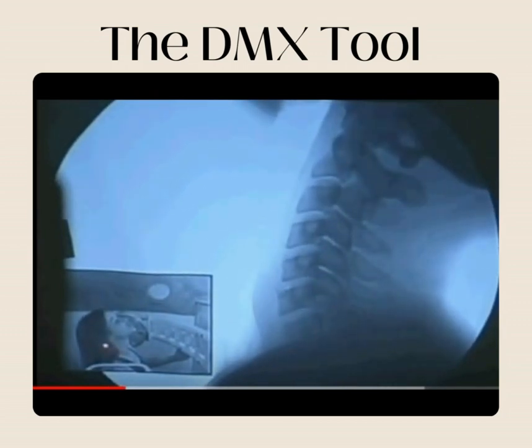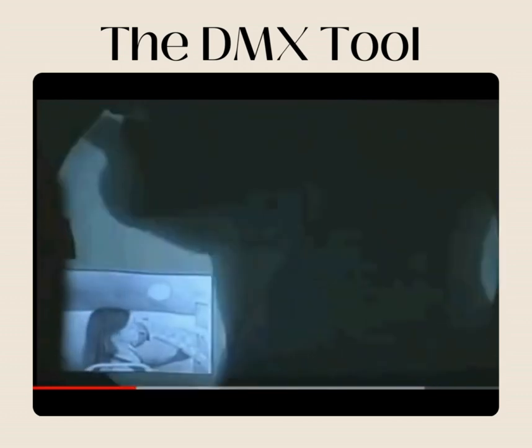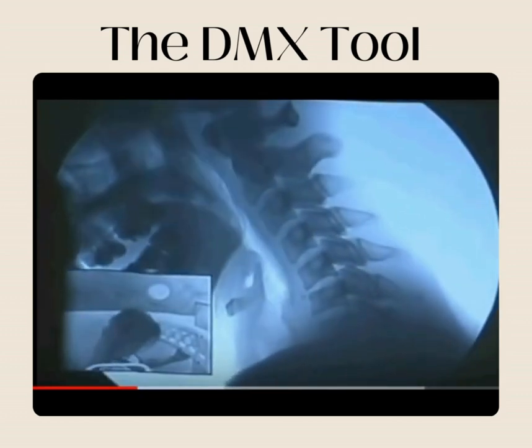So what we do is we can see Susie. Her complaint was stabbing pain when she looks up towards the ceiling. And if you follow this George's line up, right there, bam, it comes back. That's a shift, shearing backwards, tearing of the anterior longitudinal ligament. We freeze it, we add arrows, we send the tape into the insurance company, and right there is actually that disc angulation. I mean, right there, the disc is pinching in the front, and it's gapping in the back. That's an increased disc angle, which indicates a posterior longitudinal ligament injury too. So she has an anterior and a posterior longitudinal ligament injury permanently. Young girl.